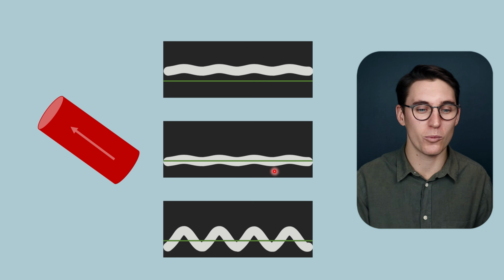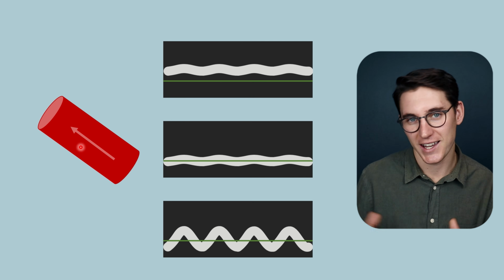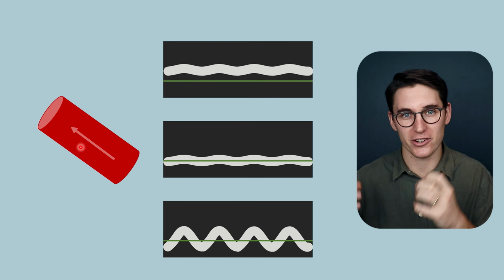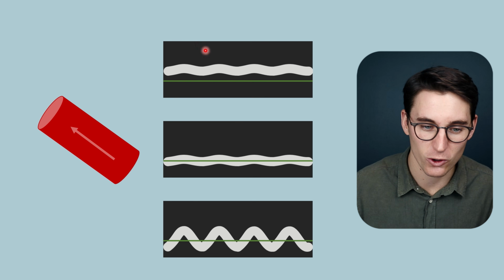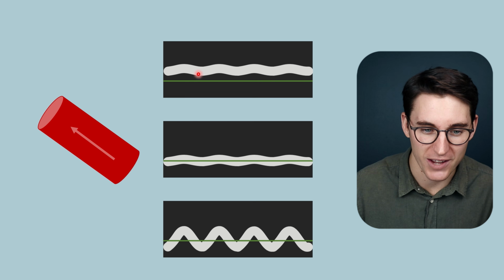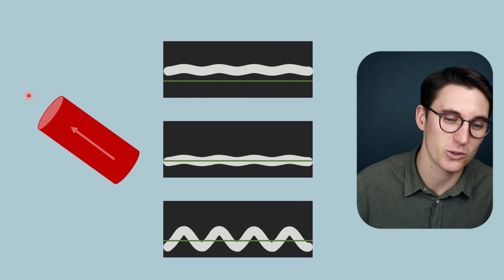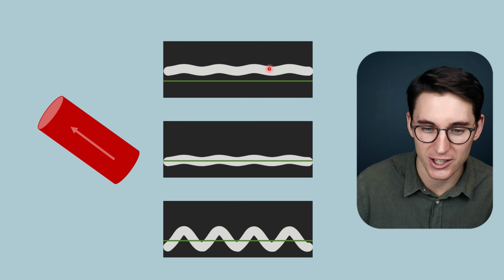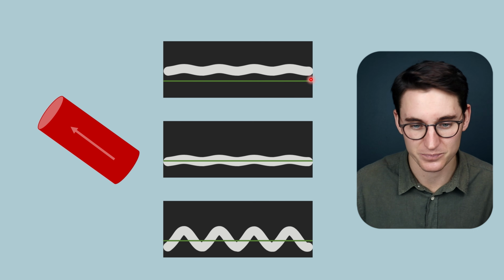Now let's look at one more example. This is the portal vein heading towards the liver. It's taking blood from the gut and from the pancreas and from the spleen and taking it towards the liver. Now in a normal spectral waveform here, we have a fairly thick spectral waveform, multiple velocities heading towards the liver, and they're generally at lower velocities, 15 to 30 centimeters per second.